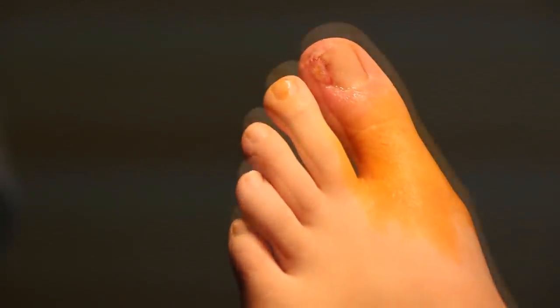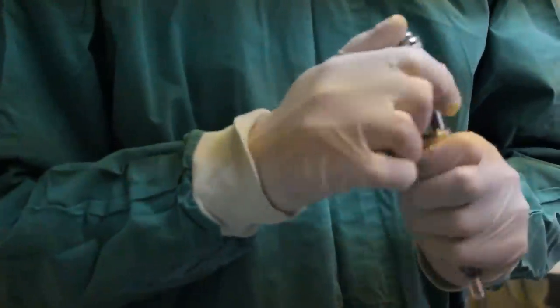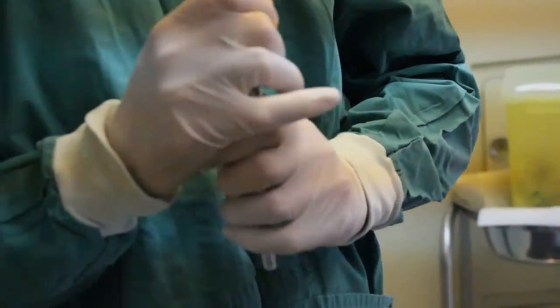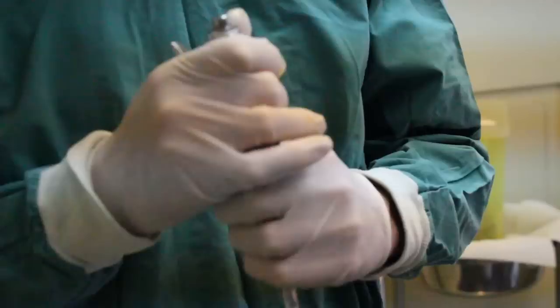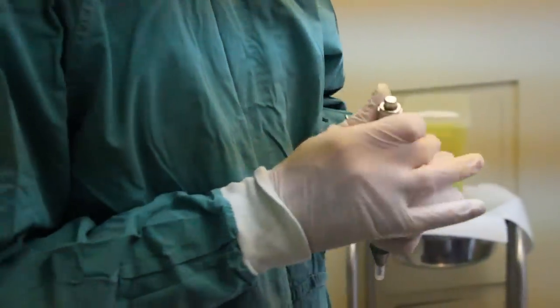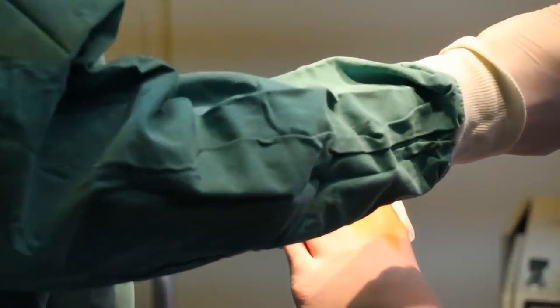I'm just putting a little iodine on your toe to reduce the chance of infection. This is a special instrument that uses air pressure to push some freezing under the skin. I'm going to tilt you back just a bit. It stings for a second — it's like a rubber band snapping against your toe. I'm not going to do it where it's the sensitive spot; I'm going to do it back here. Can you handle that?